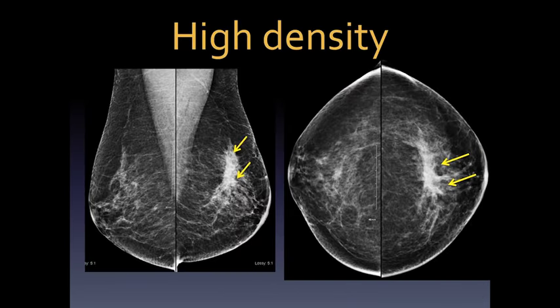Here are two limited views of the MLOs in another screen abnormality. When we look at the right breast, there is an asymmetry with respect to the other breast — the only abnormality, not seen on the CC view. This turned out to be just overlapping tissue when further investigation was done with additional mammographic views. Most single-view asymmetries are summation artifacts. One study by Dr. Ed Sickles showed that of 2,023 single-view findings, over 50% were summation artifacts, none of which were identified as breast cancer. Be careful about recalling these asymmetries, as it may increase your recall rate without significantly increasing cancer detection.